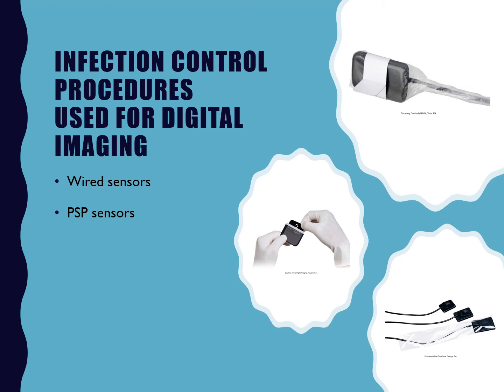With both of these, neither one is safe to put in an autoclave or be submerged in disinfecting solution, which is why it's very important that we properly barrier these items, because once the barrier comes off, they're just disinfected and then a new clean barrier is put over. And so the barriers themselves need to remain sterile. You must use the barriers that are meant for these kinds of things because they come in packages that are sterile. You wouldn't use maybe food saran wrap or something like that, because we don't have a guarantee that that item is sterile when it comes to us.